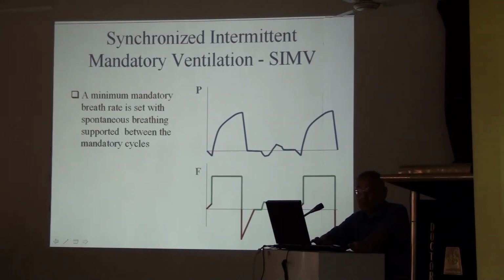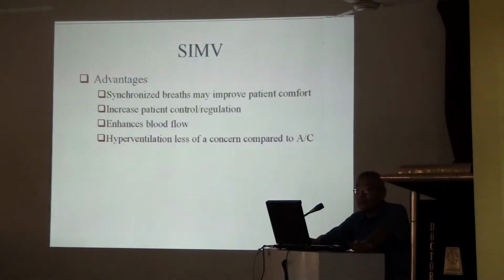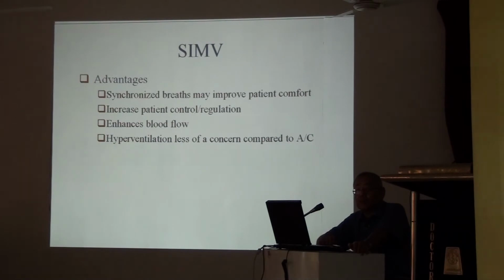This is SIMV, already I have described. What are the advantages of SIMV? Synchronized breath may improve patient comfort, increase patient control and regulation, and enhance blood flow. Why? Why does blood flow improve in SIMV?